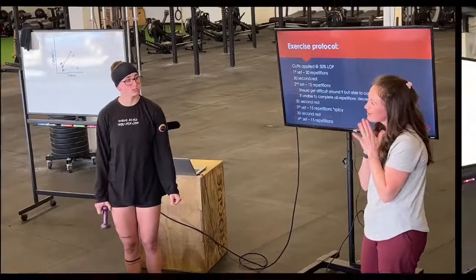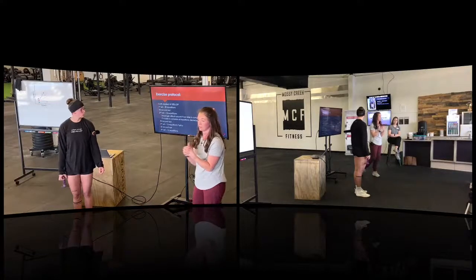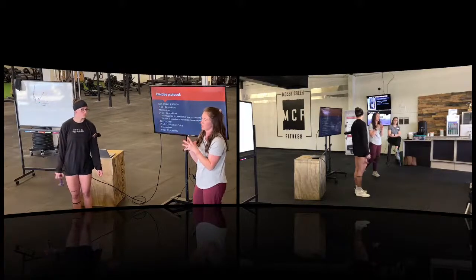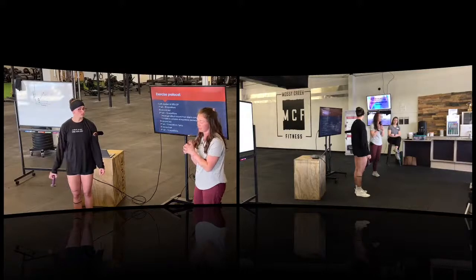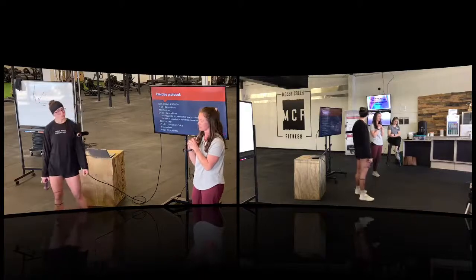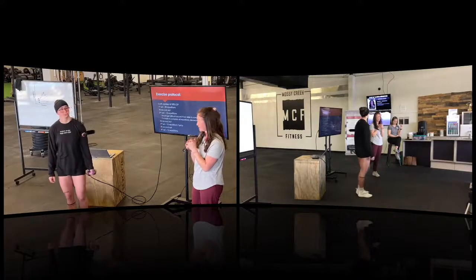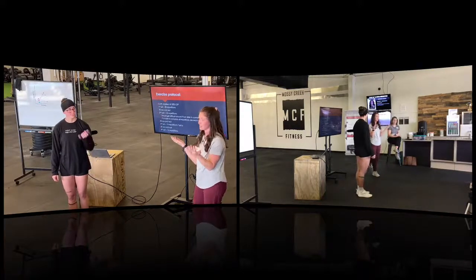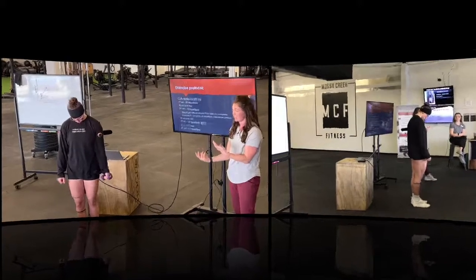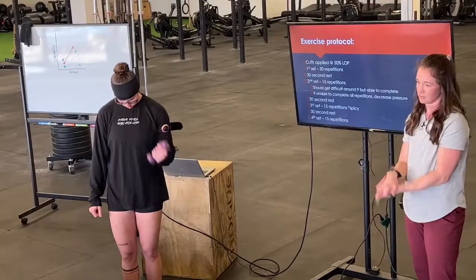And I don't want to get into that because I know that there are a lot of bodybuilders and people that are just strong that use it for other reasons. So in those situations where I don't know the answer, I just ask them, what's their belief? Where are they getting their evidence from to support use? But in an injury setting, this is how we would use it. It works really well for, and sometimes it's not injury, sometimes it's overuse, or well, I guess that is an injury, but like tendonitis, tendinopathy, things like that that are holding you back from progressing in the gym. It's good for those types of conditions as well.